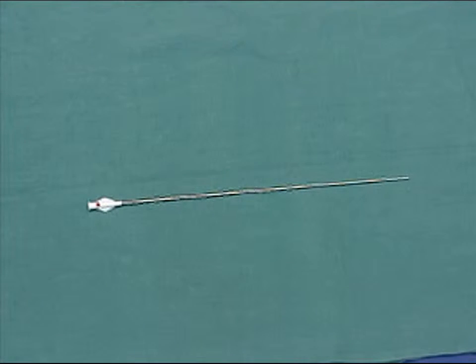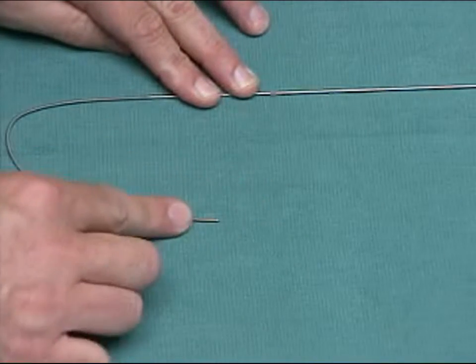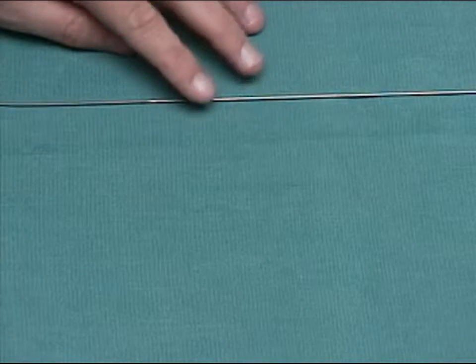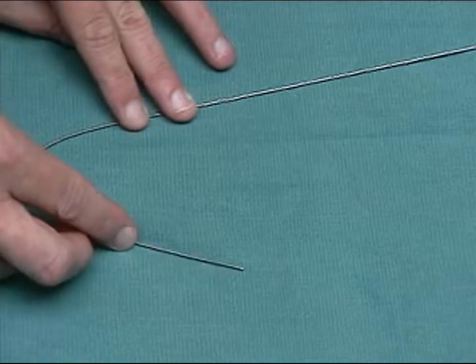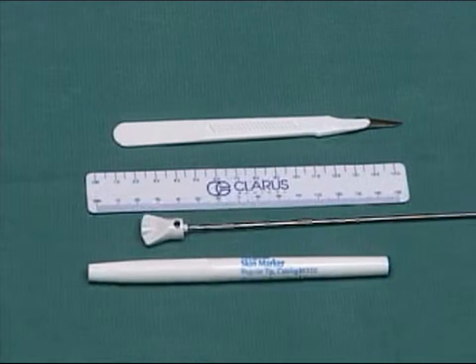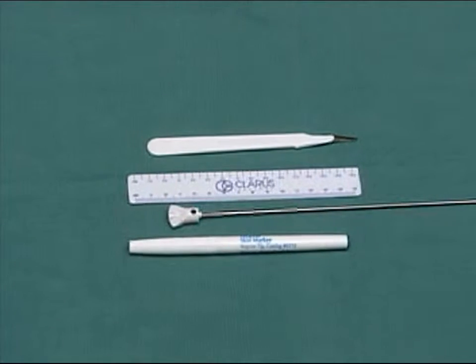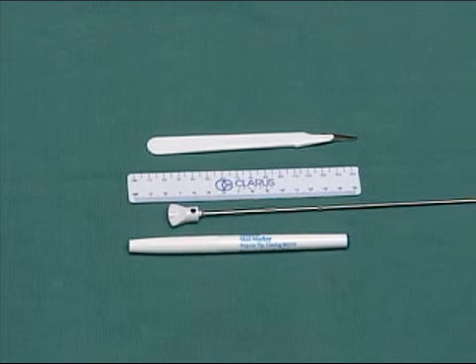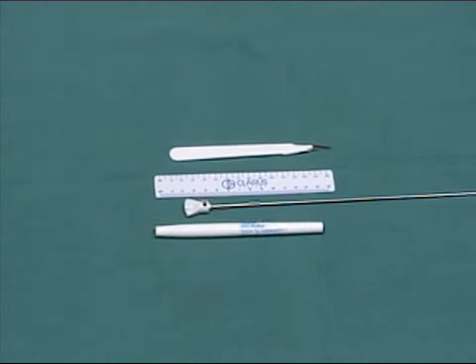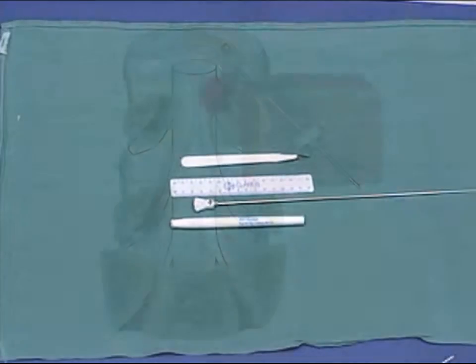Straight and curved working channels are available; the curved working channel is sometimes required for the L5-S1 disc. The dilator fits inside the working channel and makes the working channel's tip less traumatic. You will use the LASE kit's trephine to cut through the annulus — identify it by its red dot. The LASE kit contains a flexible guide needle, which is the first kit component to enter the patient's body. You will pass the dilator-working channel pair over the guide needle. The kit also contains a scalpel, a ruler, a stylet, and a pen. The stylet, packaged inside the trephine, can be used as a sterile pointer or to push disc fragments blocking the working channel out of the way.